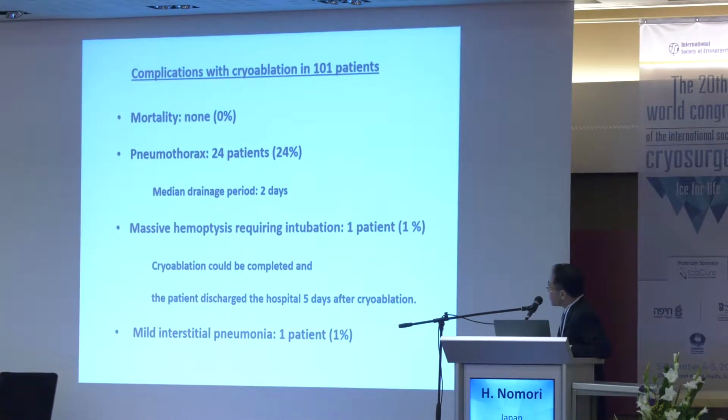This is a complication. There was no mortality, and the pneumothorax was seen in 24 patients, but the median drainage period was just 2 days. And massive hemoptysis requiring intubation was seen in 1 patient. But for this patient, cryoablation could be completed, and the patient discharged the hospital 5 days after cryoablation. And mild interstitial pneumonia was seen in 1 patient.